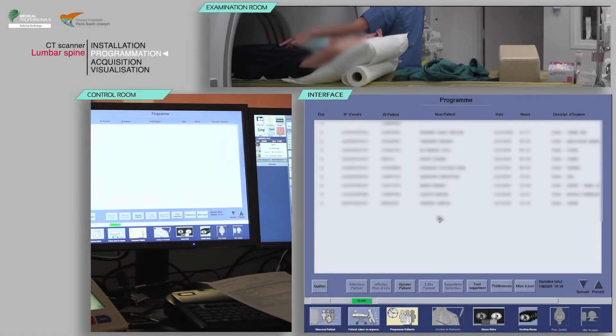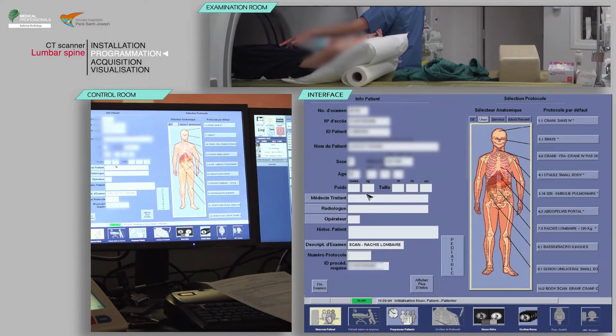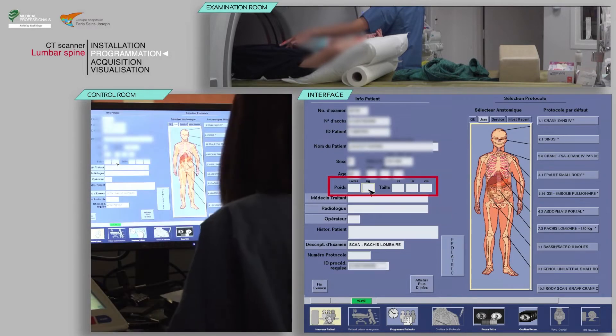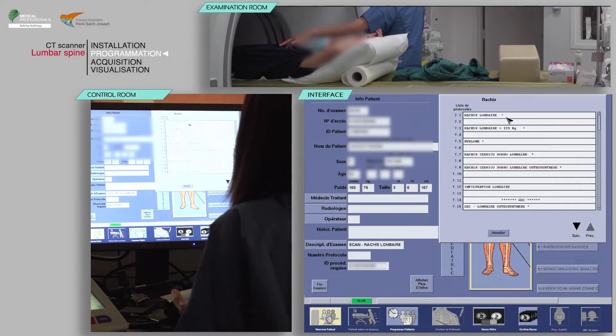Select your patient from the work list, then click on patient selection. Verify the pre-filled information and fill in the weight and height. Finally, choose the appropriate protocol.